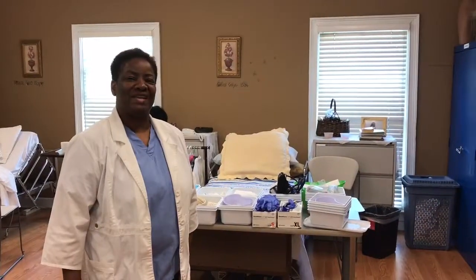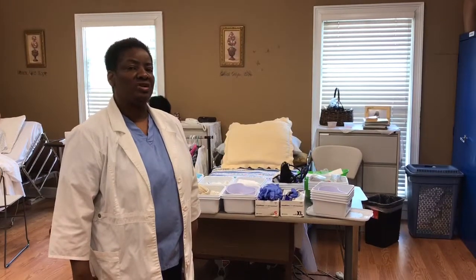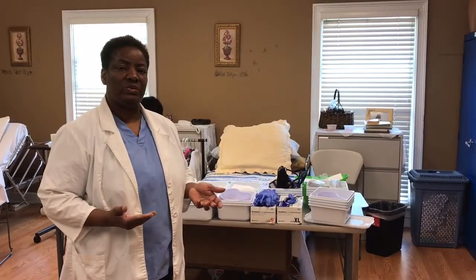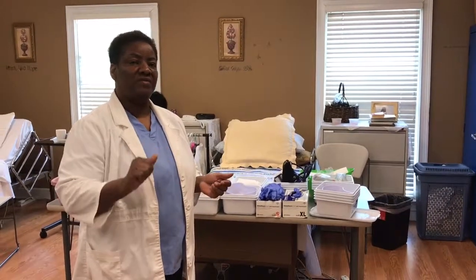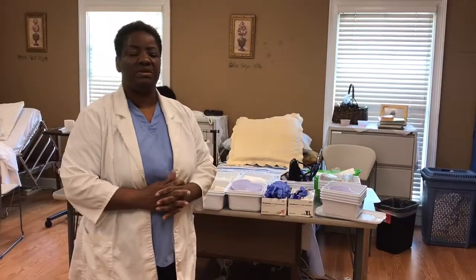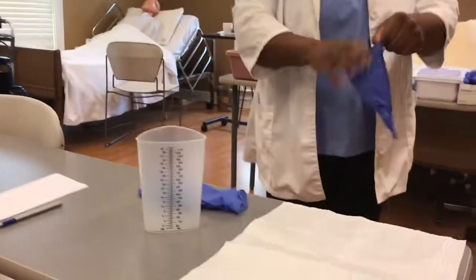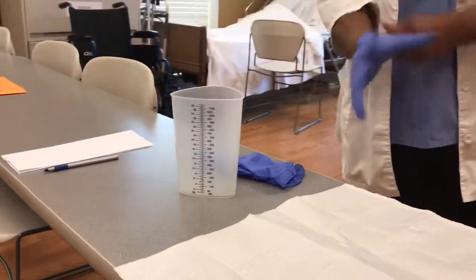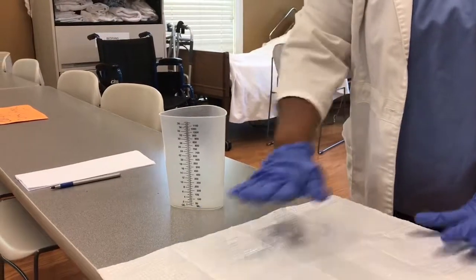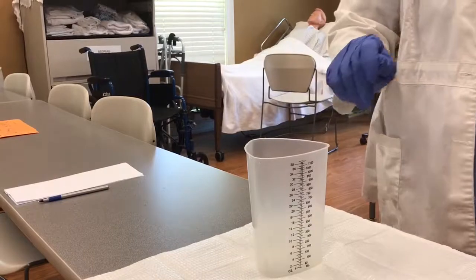Good afternoon, my name is Angela and today I'm going to be performing measuring of urinary output. The first things I do are provide privacy, wash my hands, and collect my equipment. I'm going to put my gloves on first, then put out a barrier, and then I will collect my graduate.